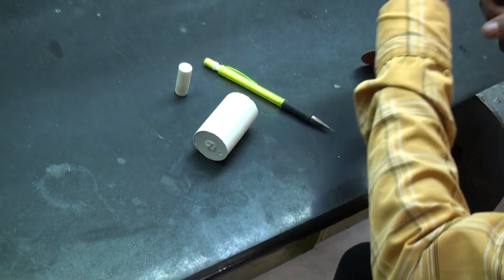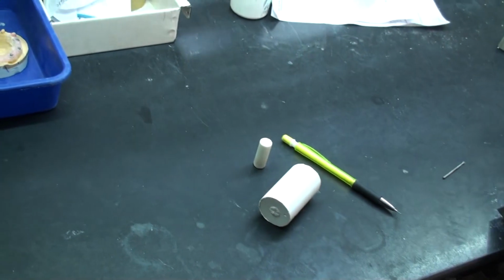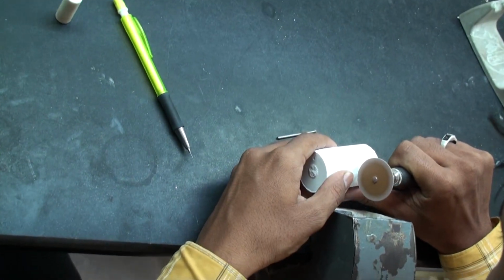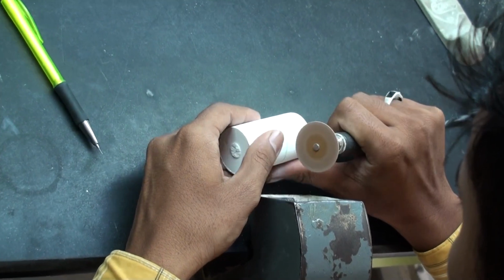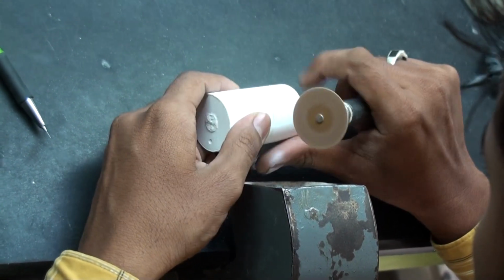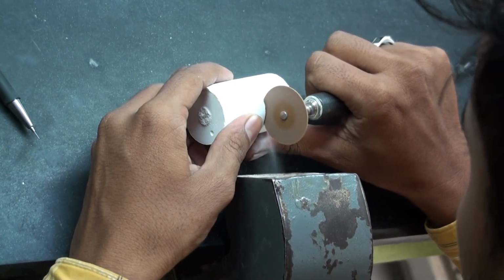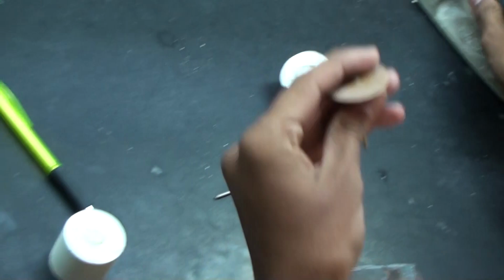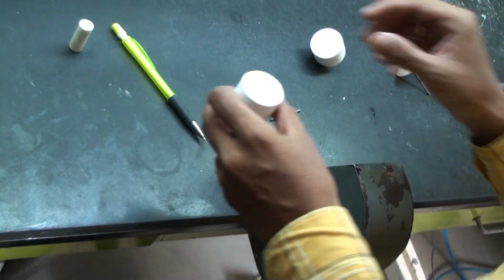And then you let the rings sit on the bench, let it all cool down. And here we're trying to retrieve our material, the pressed material. So as you can see, he measured it correctly, and he's using a broad disc to try and slowly cut away into the ring. There we go. So that's the material that's on the inside. The pressed ceramic material is inside this.